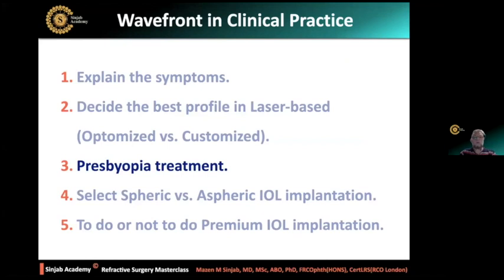I'm not going to talk about deciding the best profile in laser, because this will be the third presentation, inshallah. In presbyopia treatment, I'll show you the principle of the spherical aberration, the importance of the spherical aberration, and the depth of focus.